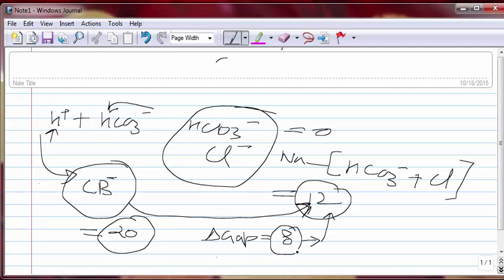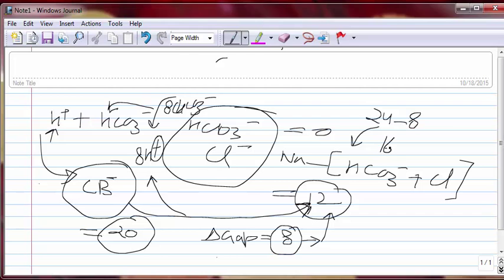So if there are 8 negatively charged ions in the body, they must have released 8 protons in the body, right? And those would have been buffered by 8 bicarbs from the body. So if you take normal bicarb as 24, the present bicarb on the ABG strip in this patient should be 24 minus 8, which is 16.